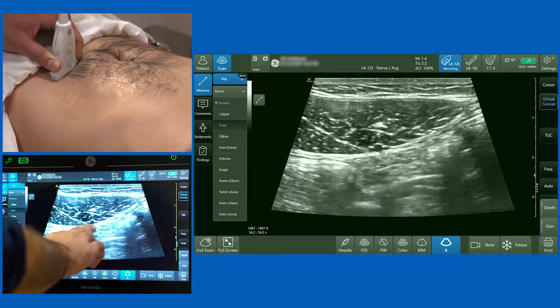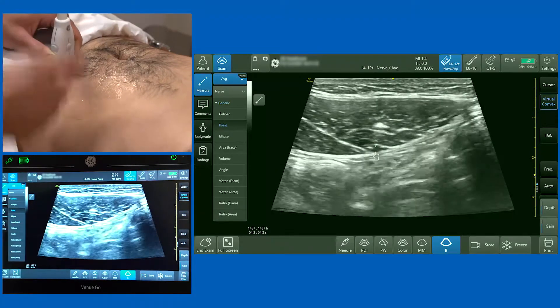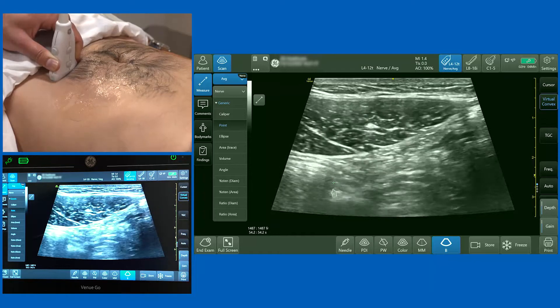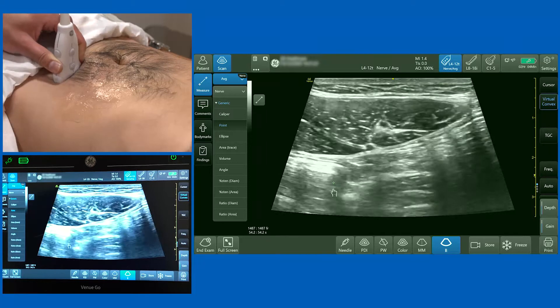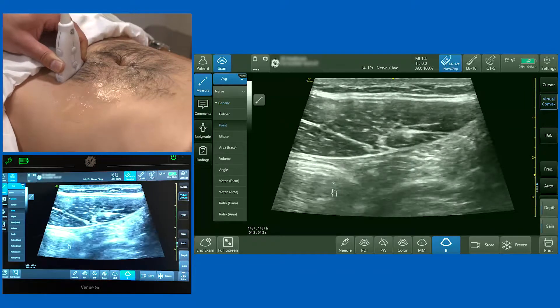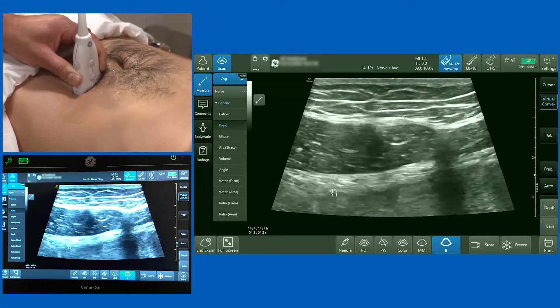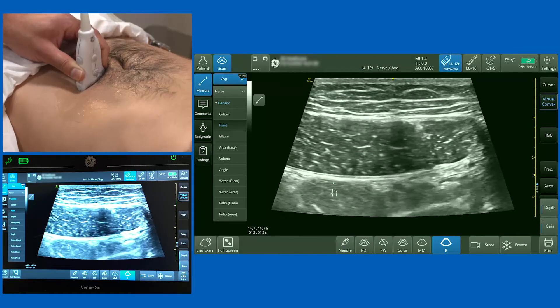Also visible here are the inferior epigastric artery and accompanying veins — as you scan further down the abdominal wall you see those inferior epigastric blood vessels, which you clearly want to avoid when performing the block. So whenever you're performing a rectus sheath block, you want to be above the arcuate line. Scanning upward, you'll see those epigastric vessels pass within the substance of the muscle. Going further up, we now clearly have two lines below the rectus, confirming a posterior rectus sheath is present.